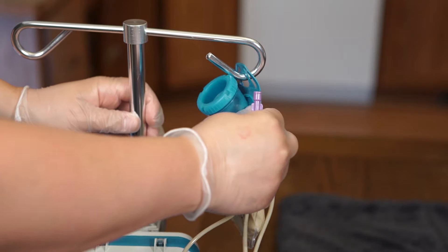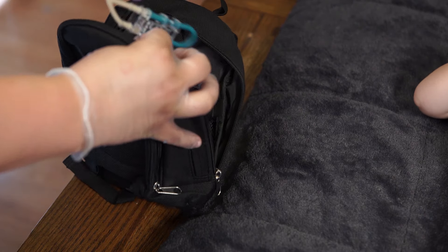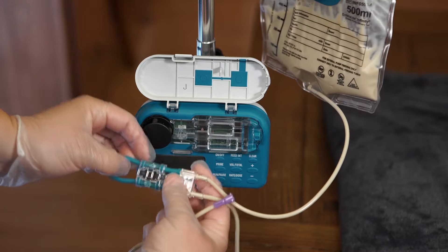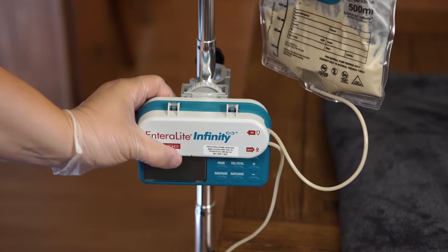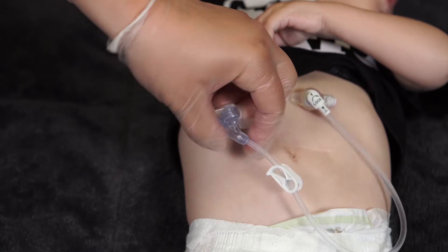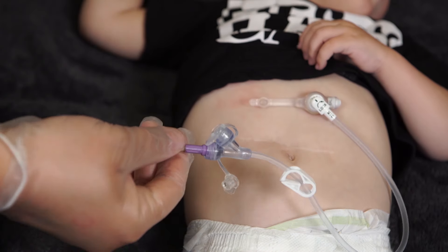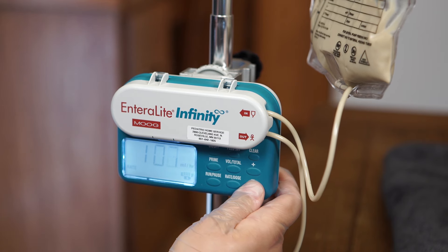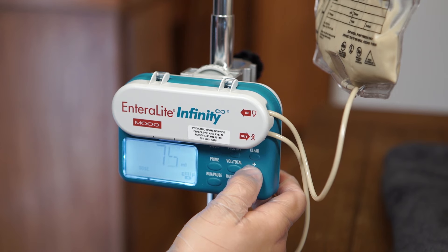Hang the food pump bag on the IV pole or place in a backpack. Connect the feeding bag tubing to the food pump. Attach the end of the feeding bag tubing to the feeding tube or extension. Open any clamps on the feeding tube and extension. Turn the pump on. Set the rate and dose on the enteral food pump.